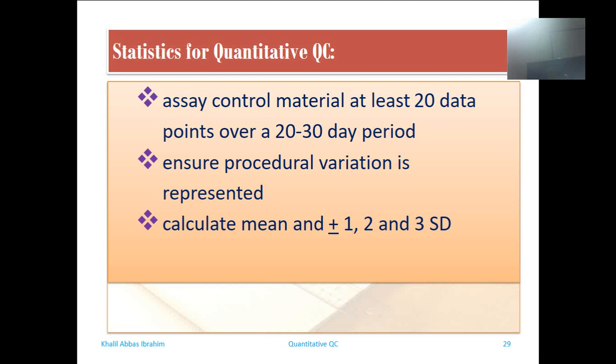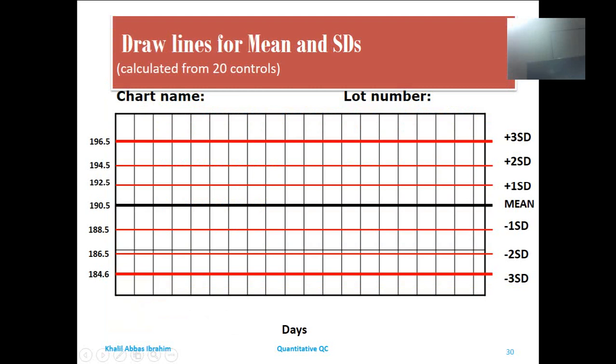Then you calculate the mean, and then plus or minus 1 standard deviation, and plus or minus 3 standard deviations. Then you draw lines according to the values that you have obtained.